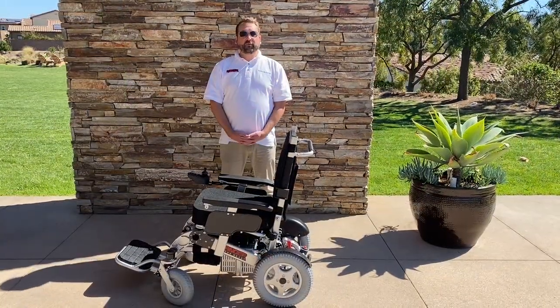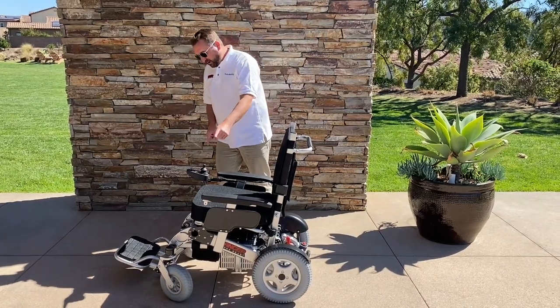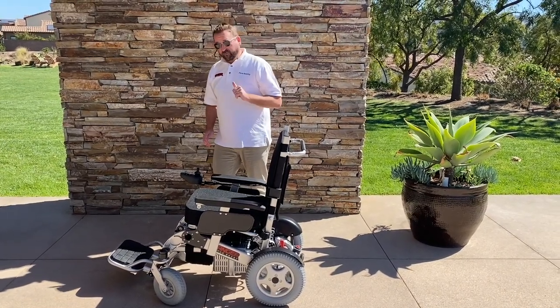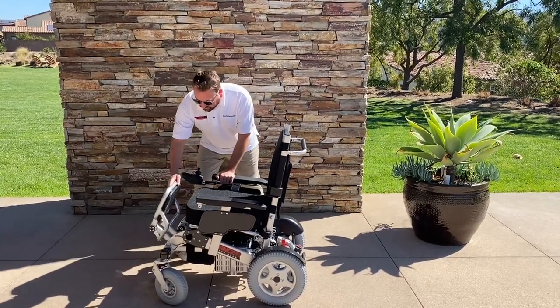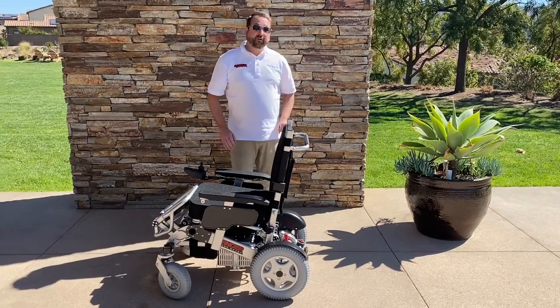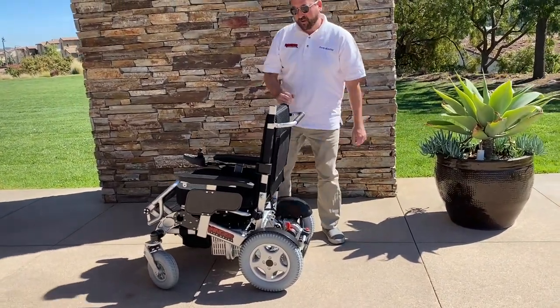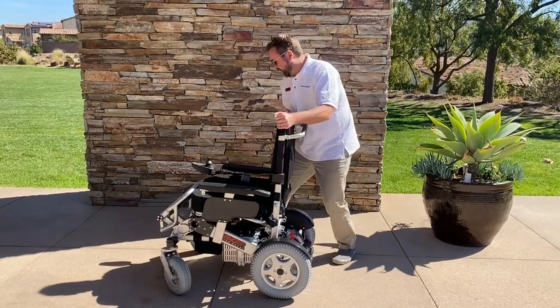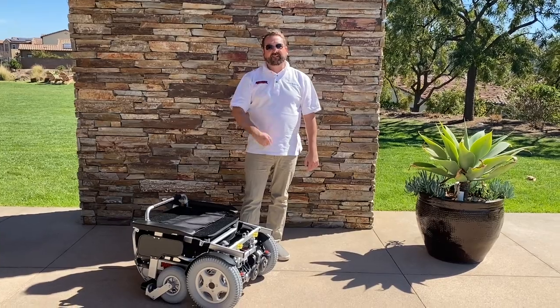Now I'm going to show you how to fold the Beast. First, you want to make sure the wheels are pointed out so they don't block the chair when it folds. Then bring up the footrest — simply fold it up and in. Then open up the latch in the back like so and simply push the chair down. There you go — folds in under five seconds.